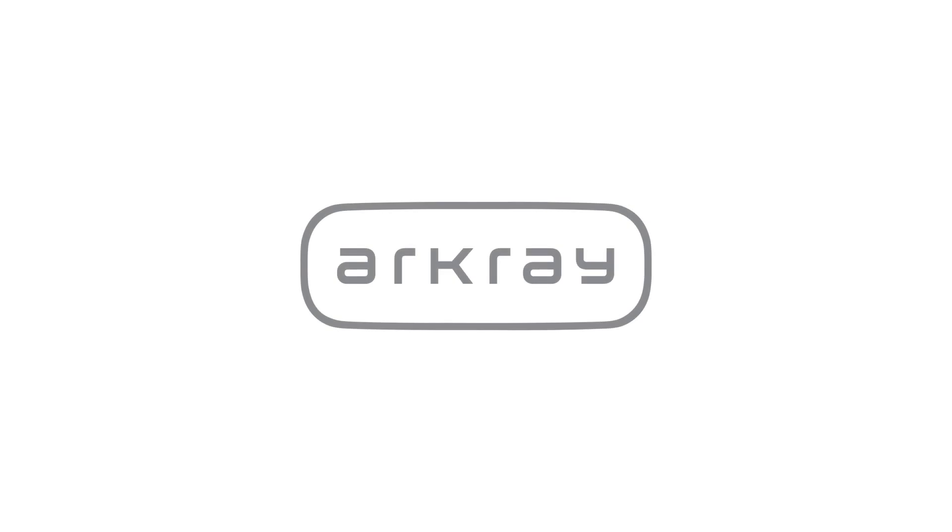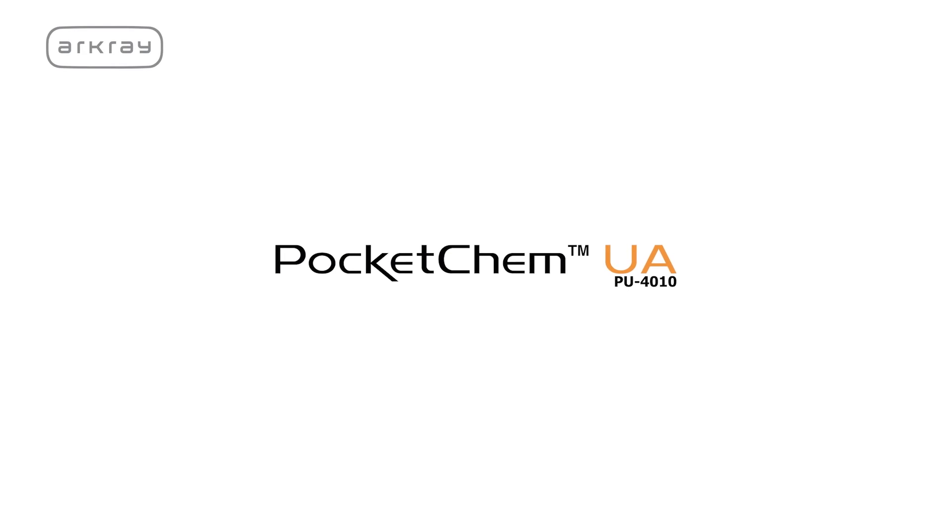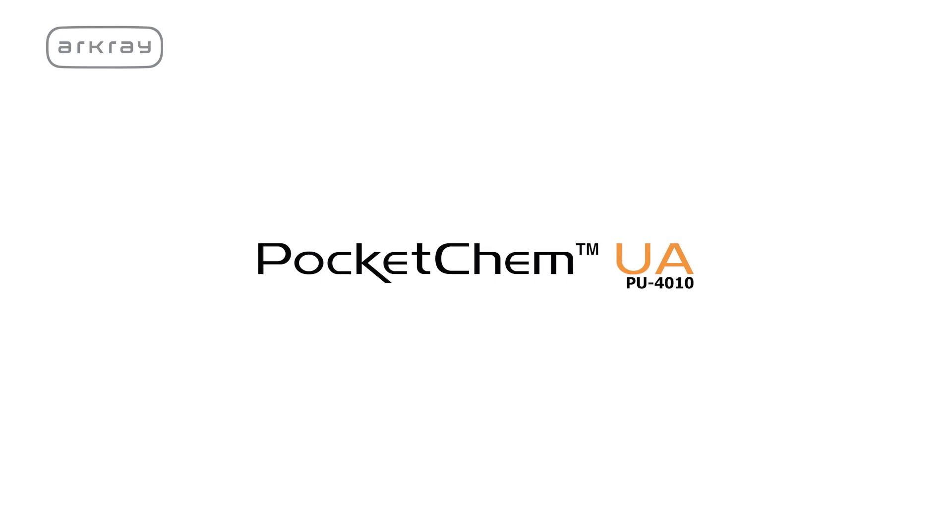R-Cray, one of Japan's leading diagnostic companies, brings to you Pocket Chem UAPU4010, a versatile microalbumin checker.